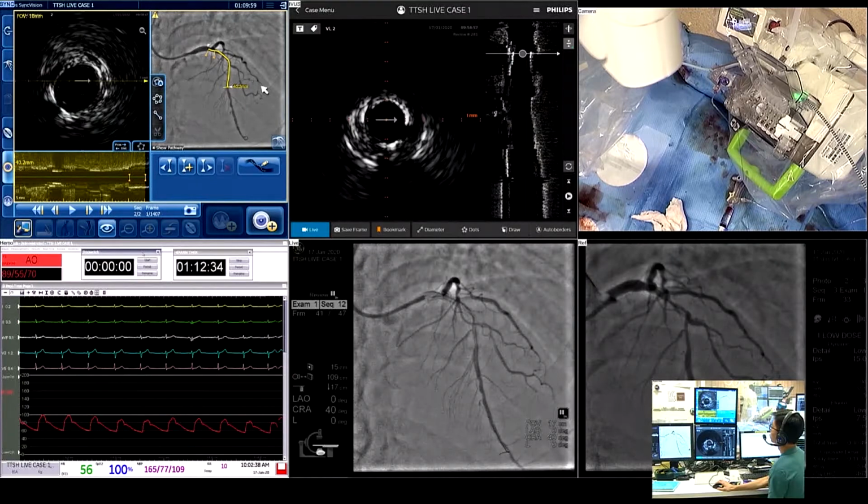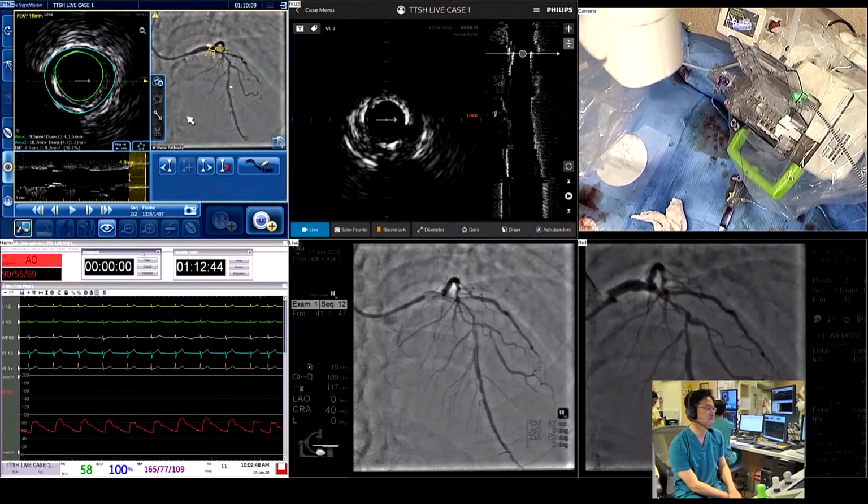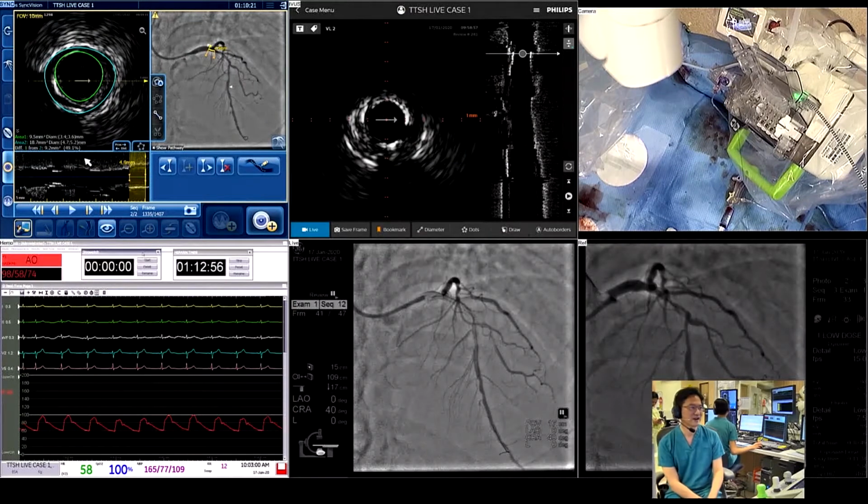So if you guys are okay with this, with a dissection there, I think I'll just go on the stented. So can I open an Osiro Mission stent, 3040? The Mission stent is the latest version of the Osiro stent. So this is essentially the same stent, but mounted on a more deliverable system. So we'll see how it copes with the robot.